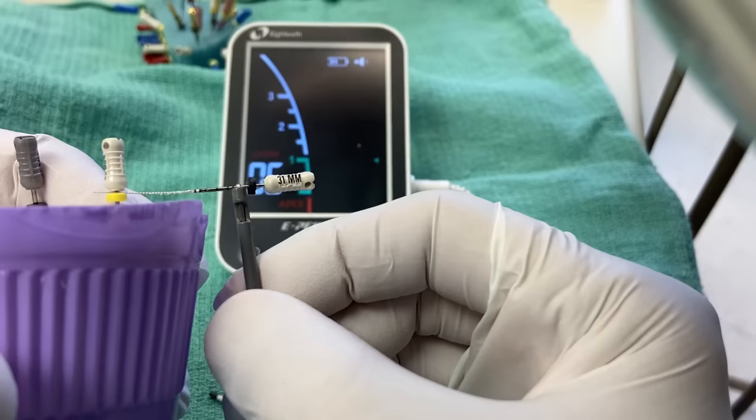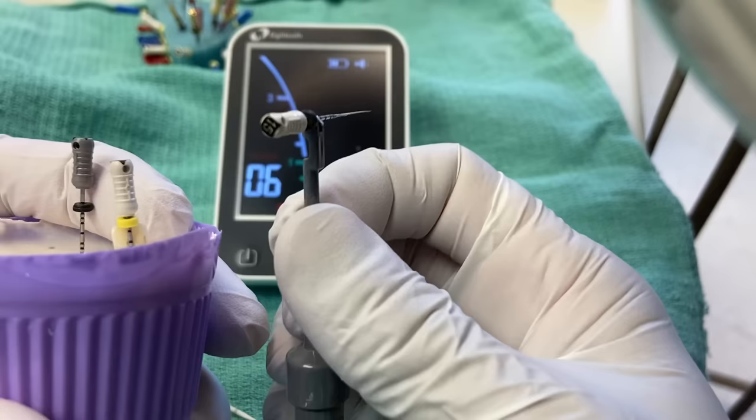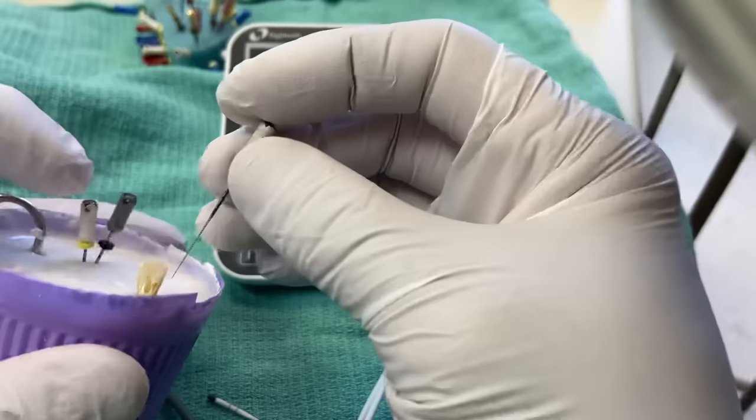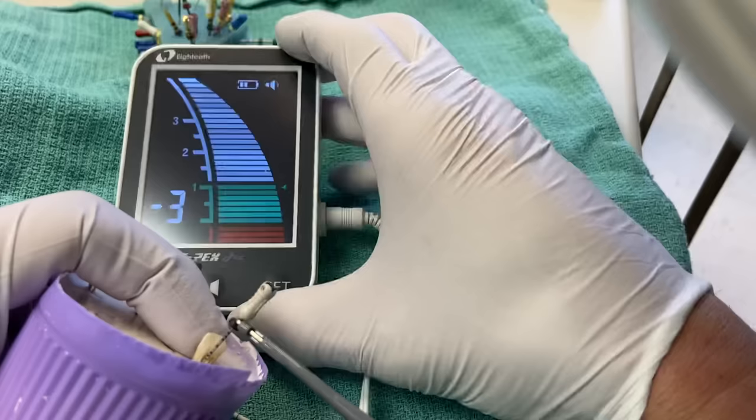A quick tip: you can measure the dimension of your rubber stop — these are 1.5 millimeters. Knowing that dimension lets you quickly estimate your working length even when the stop is snugged down. Sometimes it's frustrating getting access, so just make sure things are easy to reach. A 31-millimeter file is helpful for working length because it gives you more space to work with.